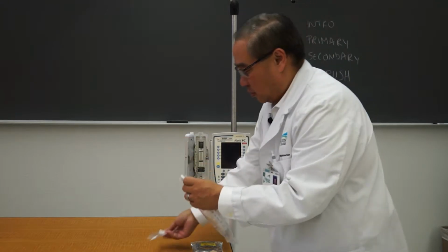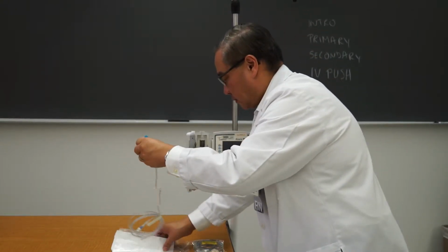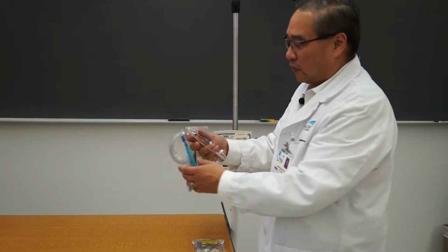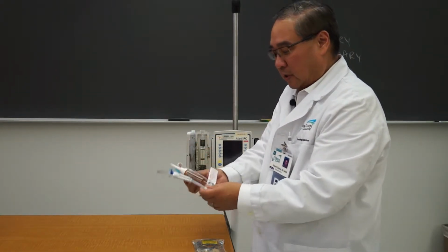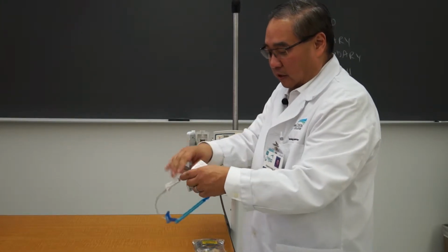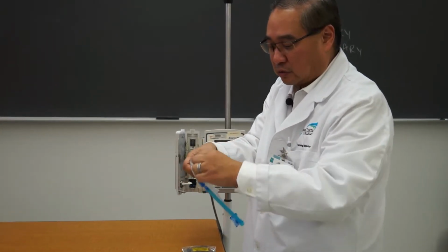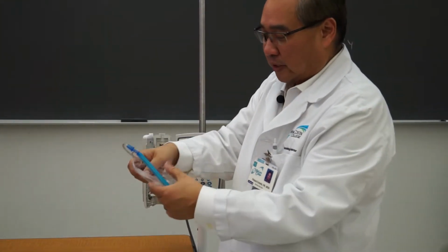You will then open up the tubing. When opening the tubing, it's very important to remember though that you should always have control over the tubing itself, especially the ends. If it touches the ground, then I will consider it contaminated if it gets dirty. Now there is tape holding it on. You can just basically tear off the tape itself and discard it into a trash receptacle. And once again, I'm controlling the ends.